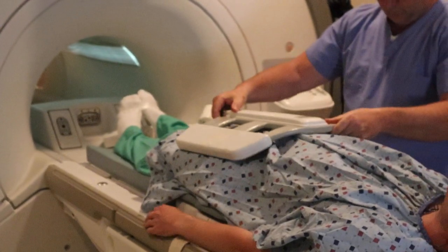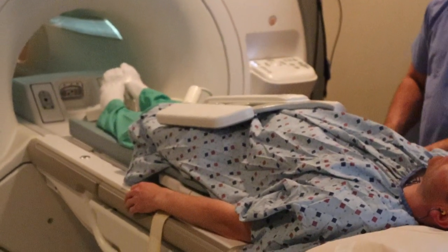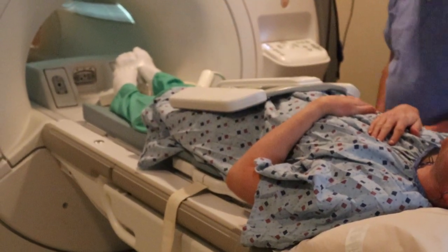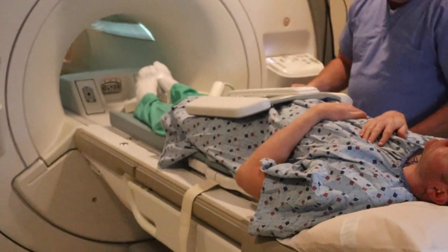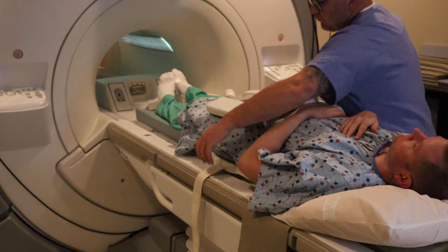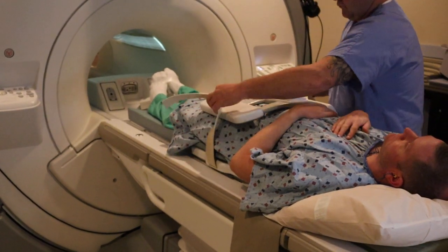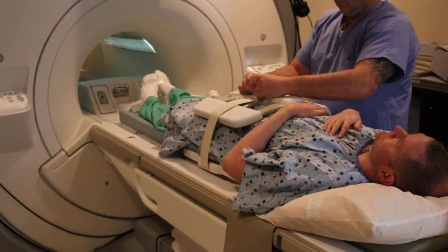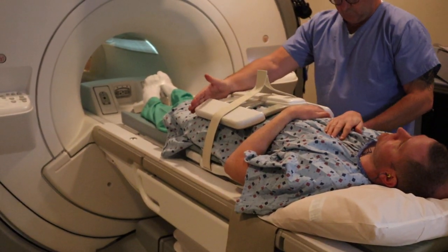You're going to fasten the anterior piece of the coil. Hands are going to be out of the field of view. Then you're going to strap in the coil. You want to make sure that the anterior and posterior pieces are at the same height on the pelvis.